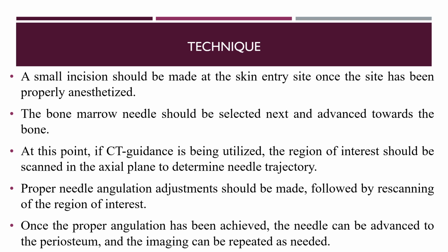In case you want to go with cytogenetics, you will use the heparin tube. In case you want to go for flow cytometry, then you will use the EDTA tube, right? So that is about the cytology. And if you are collecting the biopsy sample, then you will require a specific transport medium, okay, or a sterile box.